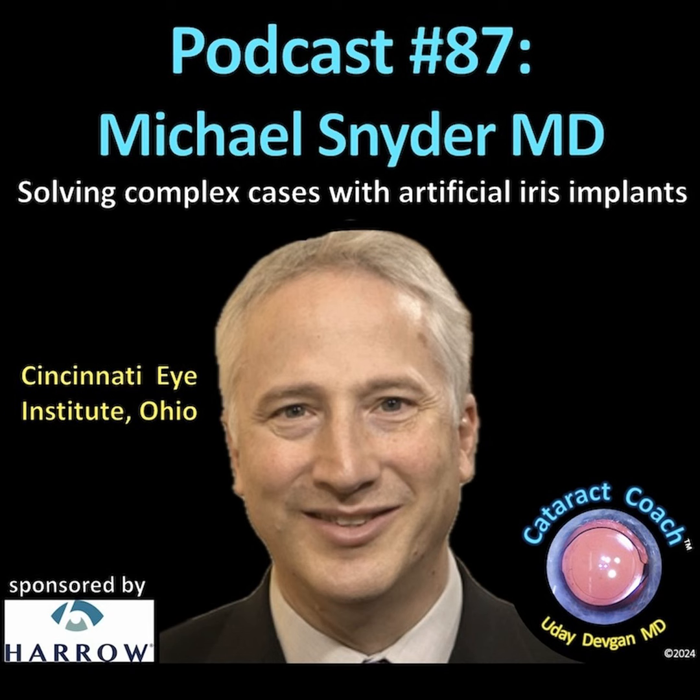For example, there's a case that I did just this week. The patient had extraordinarily high regular astigmatism and already had corneal relaxing incisions in place. And so there was no real good way to get after that 6 diopters of astigmatism. So I actually sutured a 6 diopter toric IOL to the back of the device and then oriented the whole complex so that the toric axis was on the steep axis. And at least so far at day 1, we're doing pretty good. Patient was 20/80 at day 1, which actually for one of these kinds of cases, I'm going to call that a big win.